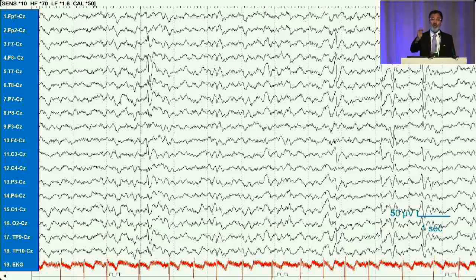In a bipolar montage, if you want to localize where this deflection is happening, you would just put one electrode to the next and compare its phase. And the point in which the phase reverses, that's the location of where the maximum deflection was, or where the pebble was dropped. If you want to understand the amplitude, or how high these waves are, how do you do that?